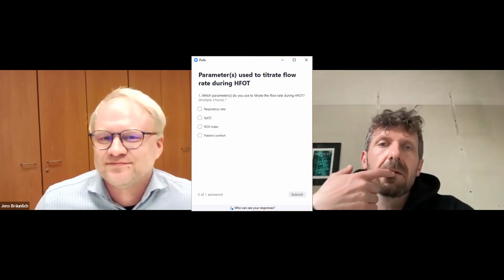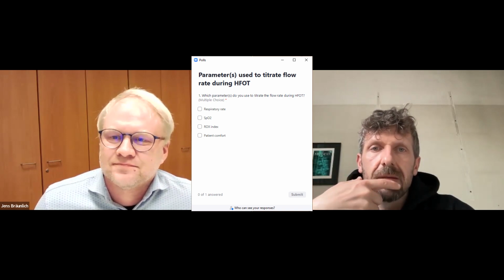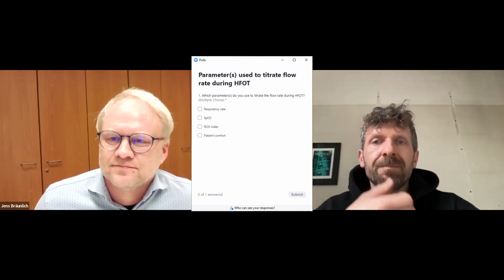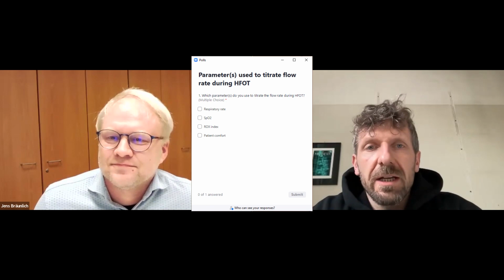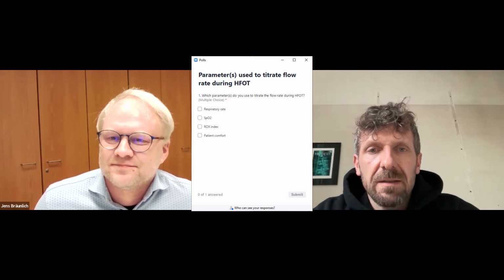I will give you another question now, and we are also interested in your idea about this topic. The topic is, which parameter do you use to titrate the flow rate during high flow therapy? So now you can vote. With this, we are also suggesting that you need the goal. You just don't put the flow and go away. You check the effect.